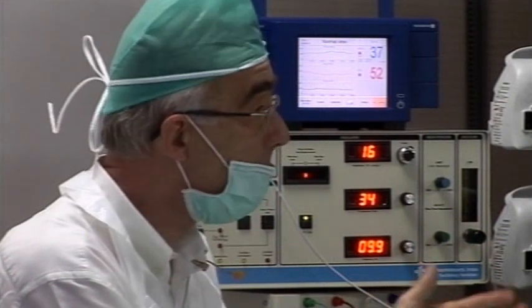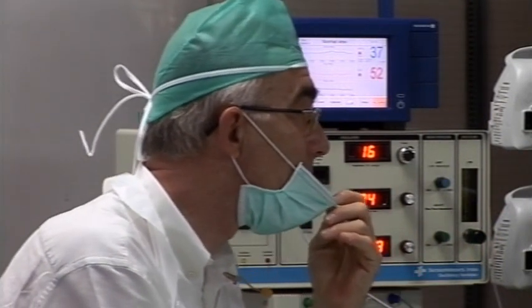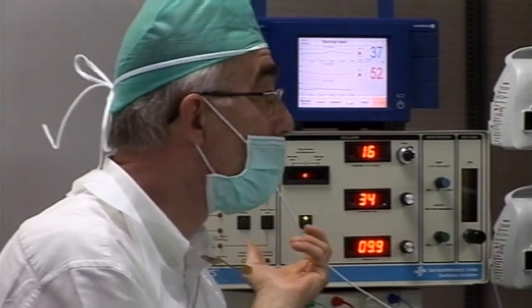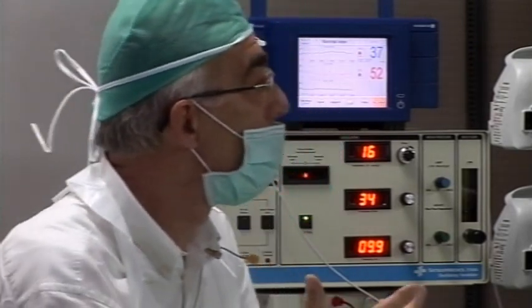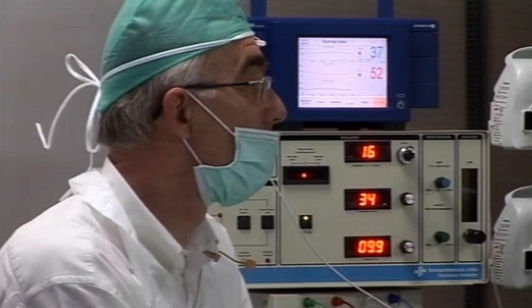If he still needs more than 30% with good CPAP, I will go to HFOV. Now it's quite often that I go directly to HFOV. I like it better because it's easy for me to intubate, and it's easy to manage. If the baby doesn't need HFOV, he won't need it for days, it will take a few hours. I'm not afraid of using that.